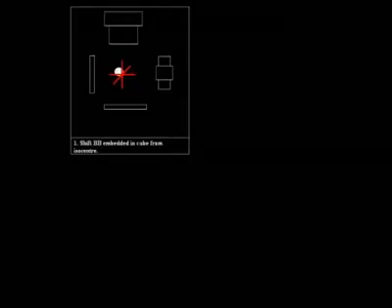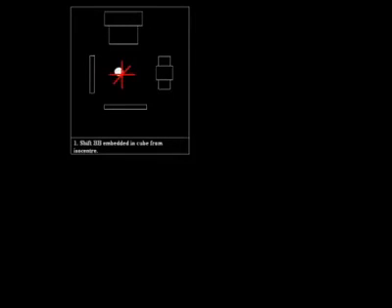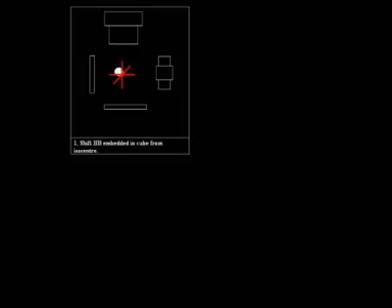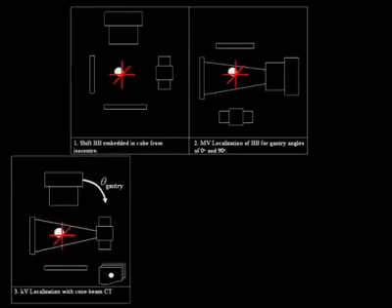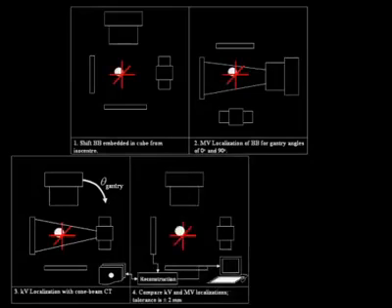And the way that we've been using it is to set the Phantom up at an offset position with respect to the isocenter. Subsequently, we take our portal images to assess the MV localization. We perform the cone beam CT to assess the localization according to cone beam CT. And we compare the localization, and again, they're slightly offset with respect to the isocenter.